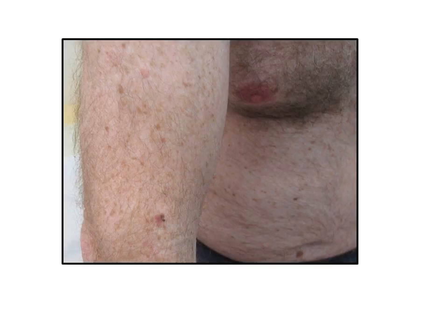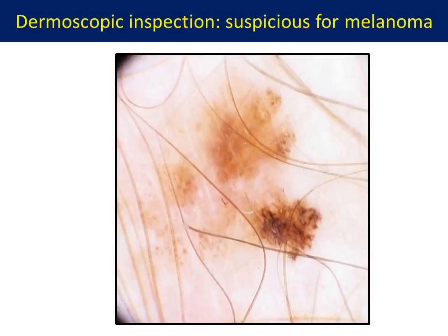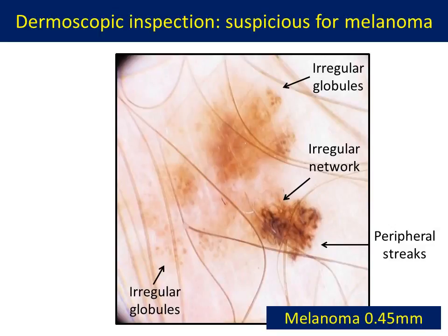Here's an example. There's no doorway melanoma here, but there is a concerning lesion. Looking closely, we can see this is a pigmented lesion, hinting that this may be melanocytic. We see an asymmetric silhouette and multiple shades of color. With dermoscopy, this lesion shows multiple criteria for melanoma: asymmetry in the distribution of colors and structures, peripheral streaks, irregular network, and irregular globules. This is a melanoma — 0.45 mm in thickness.